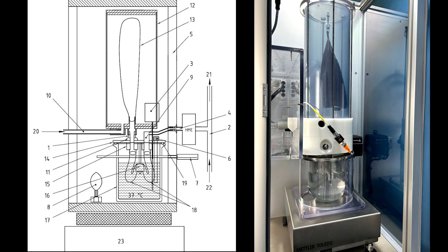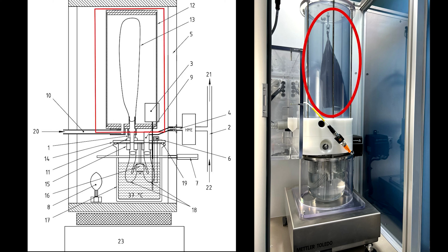The components of the humidity generator are as follows. Starting at the top we have the reservoir and airbag. The airbag simulates the lung function, inflating and deflating with each breath.